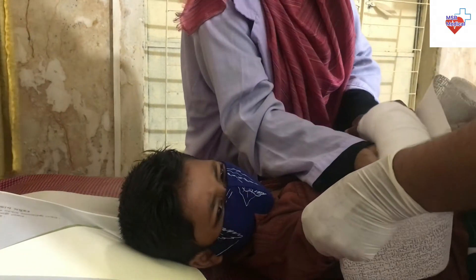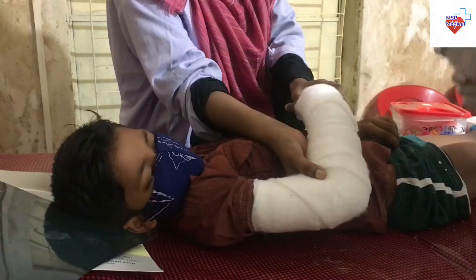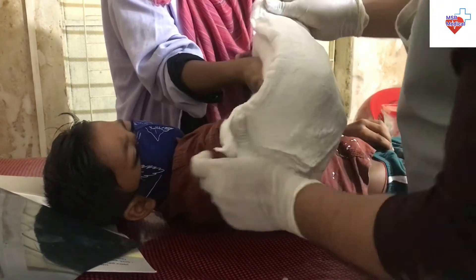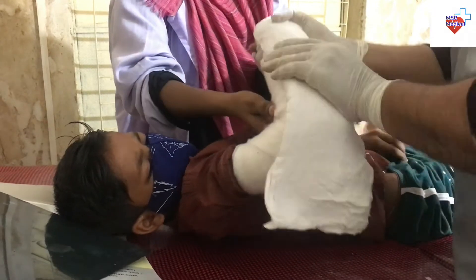The unfolded 3-inch plaster slab should be approximately 2 inches shorter than the distance from the palm or crease to the axilla. Trim the slab as needed. The folded 2-inch plaster slab should be approximately the same length as the distance from the wrist to the elbow crease.